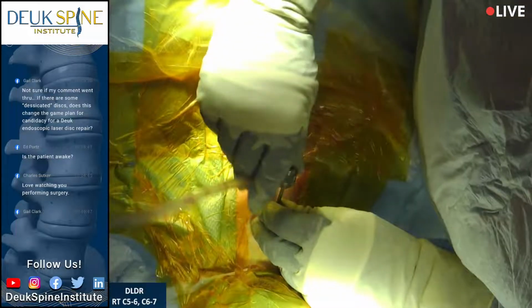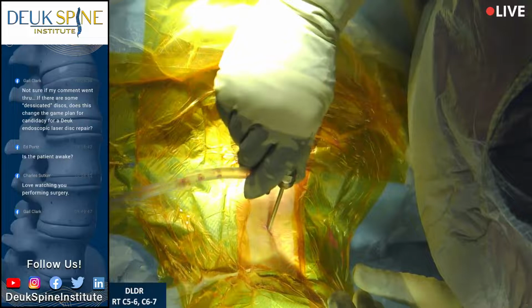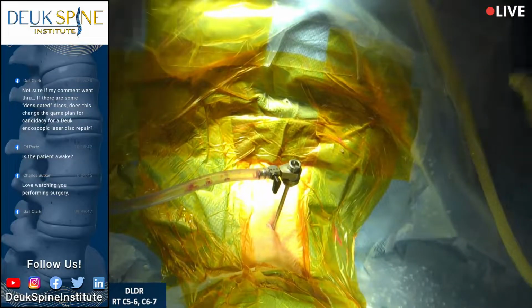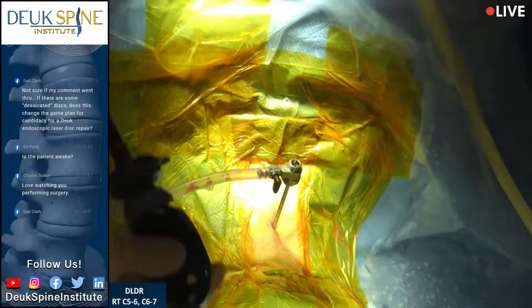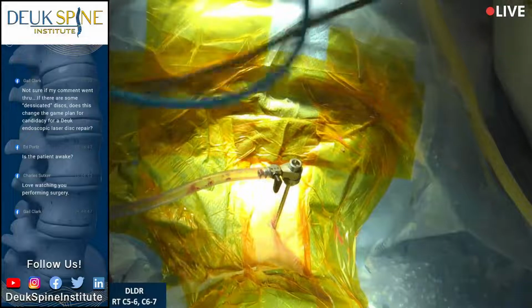Is it that they're not producing them anymore? Yeah, I have to search for it. I've got it, right there. It's good? Yeah, good. I saw that. So it's just a matter of bending it out, but at some point that's going to fatigue and stop working. So we need to replace it. Thank you very much. I'm good. All right. It's a new scope.